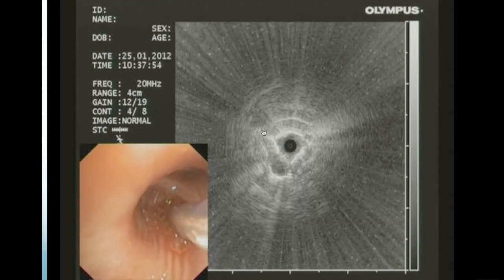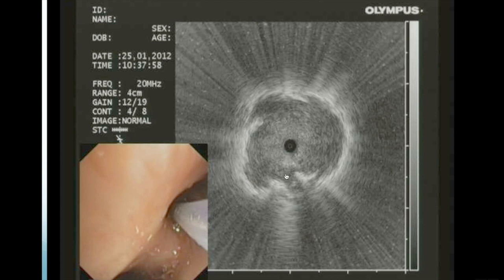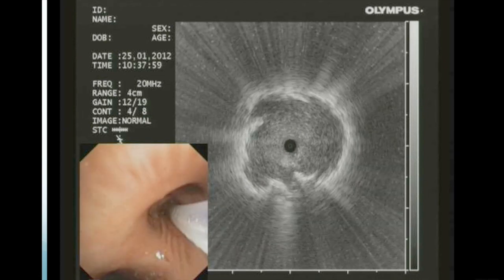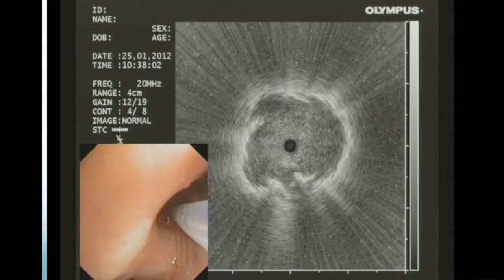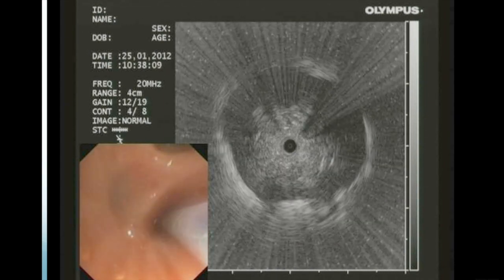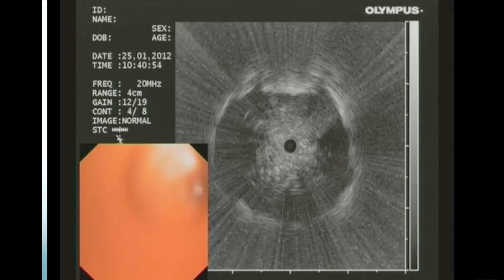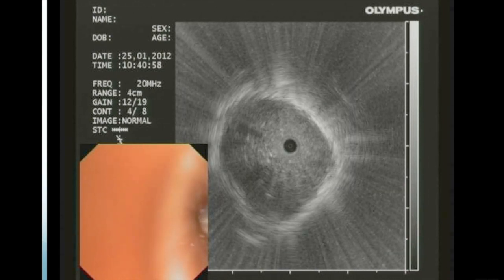We're pushing the ultrasound further out. Here's the normal air appearance of the lung, and now we're coming into the solid lesion. You can see that this area here is now solid. This white area is hyperechoic — the hyperechoic border of this lesion. This is a great ultrasound image showing us that the ultrasound is actually within the lesion, surrounded by solid tumour. As we push the probe further in, we get an idea as to the size of the lesion and the depth beyond our vision. There we've pushed past the lesion and we're just coming back into it, getting an idea of the exact position.